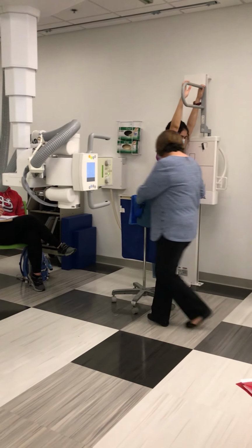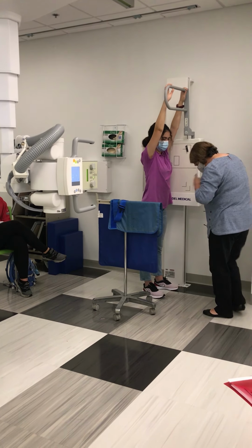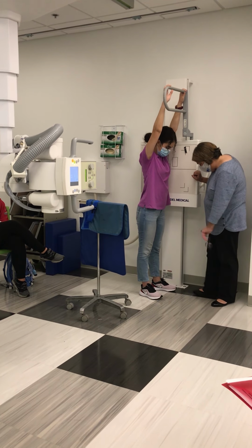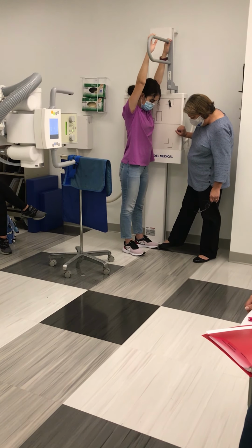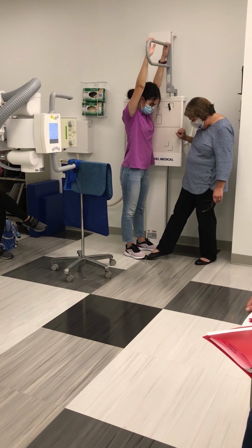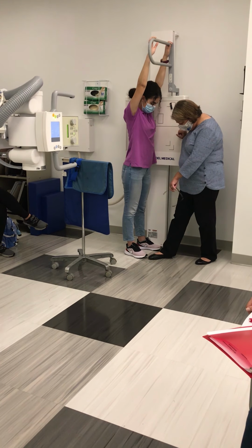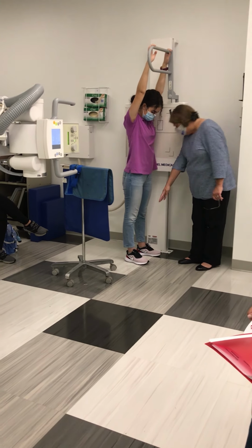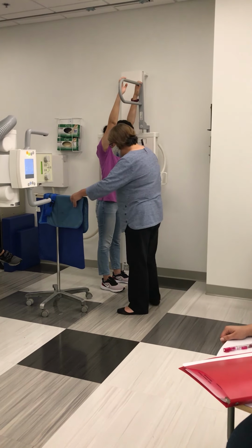All right, we want to make sure that there's no rotation, that our patient is in a true lateral. One of the ways you can tell is the placement of the feet. Don't move your feet. So I can tell that her toe on her left side is a little bit in front of the right foot. So I'm just gonna plant my foot here and say, can you just scoot that right foot forward to my foot? There you go. So they're straight across now. So that's more likely that she's lateral.